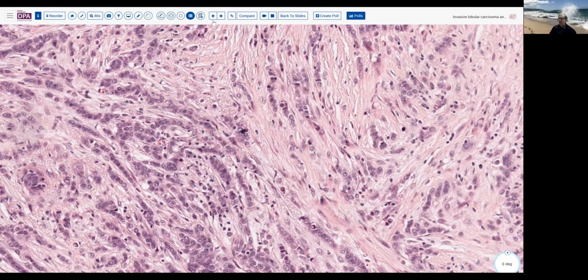So when you see invasive, think of in situ. When you see in situ, certainly keep your eyes wide open for possible subtle patterns of invasion.